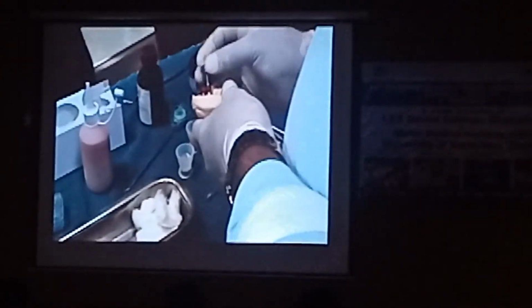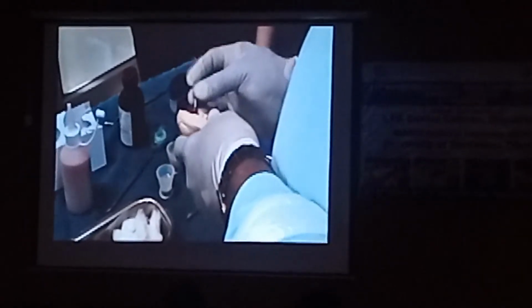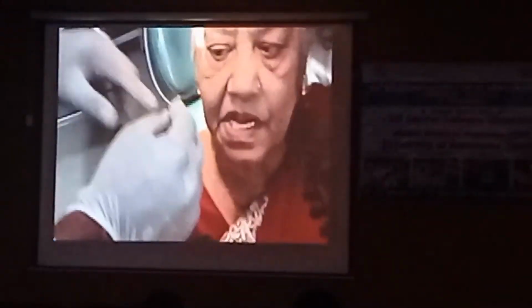That is a screw test. No, not exactly, not the right way. In a full mouth patient, you do a screw test, one screw test. That is entirely different, not something of this sort. Let's go back, I'll show you.